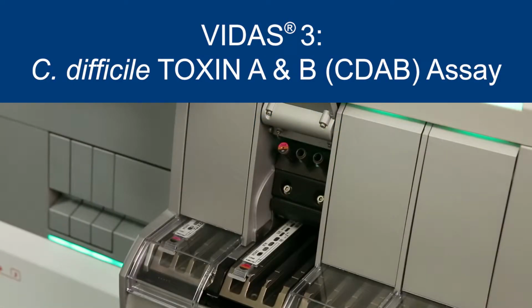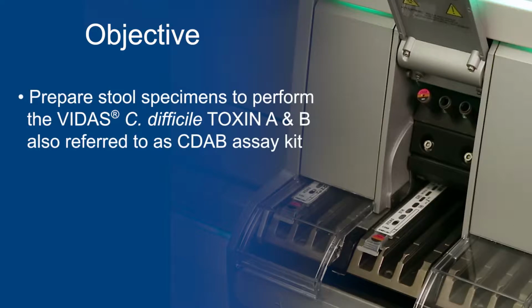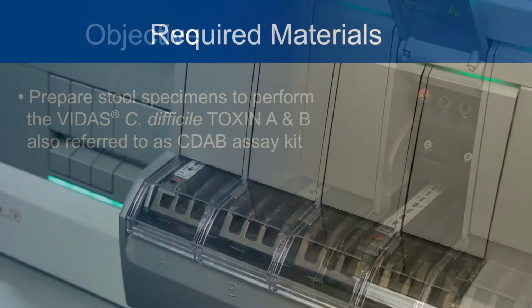This video describes the steps to prepare stool specimens to run on the VIDAS 3 instrument using the VIDAS C. difficile Toxin A and B CD/AB assay kit. At the end of this video, you should be able to prepare stool specimens to perform the VIDAS C. difficile Toxin A and B, also referred to as CD/AB assay kit.